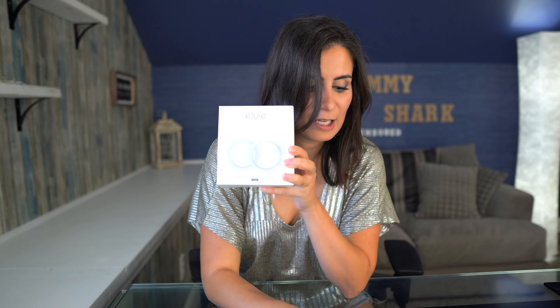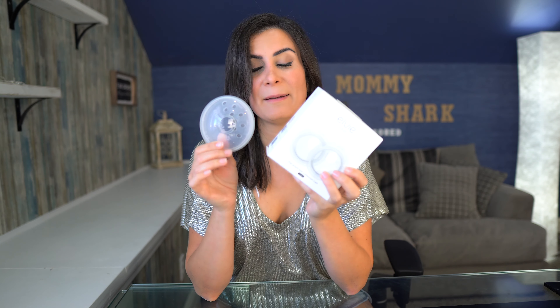Let's go ahead and jump into the Elvie Catch, and I'm going to compare this one to the most popular Medela Soft Shells. Believe it or not, these are made for two completely different purposes. I'm here to tell you about the four different purposes that these can be used for, and when one actually exceeds the other, and for which purpose.